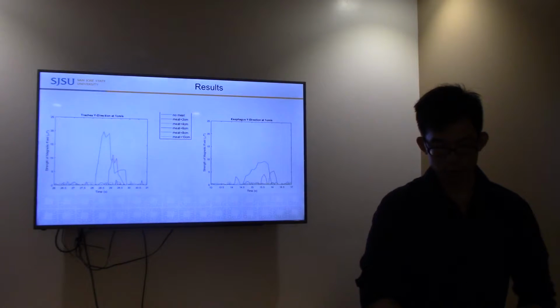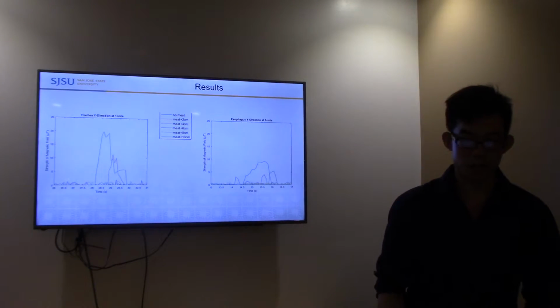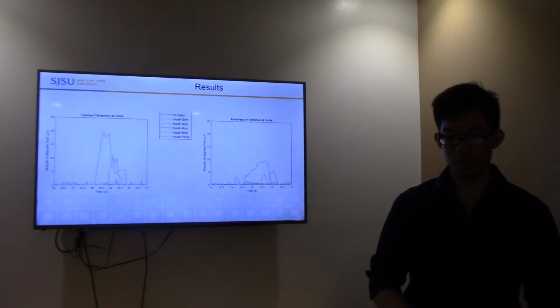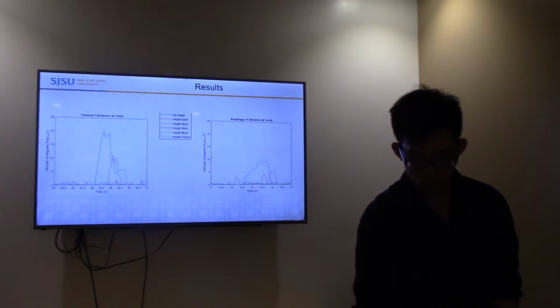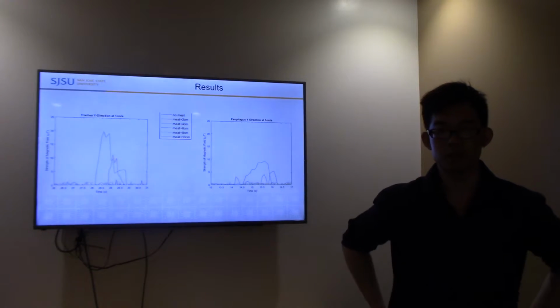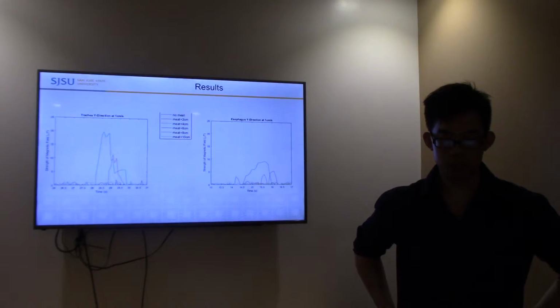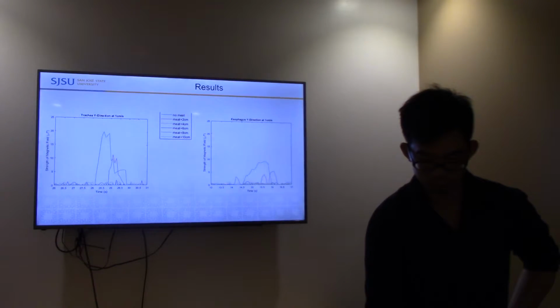And using the magnetometer, it seems like the trachea has a higher magnetic field strength, which also makes sense because it's in front of the esophagus. And the magnetometer uses a different frequency, a lower frequency than the metal detector. So it does not detect anything above 4 centimeters above the chest.